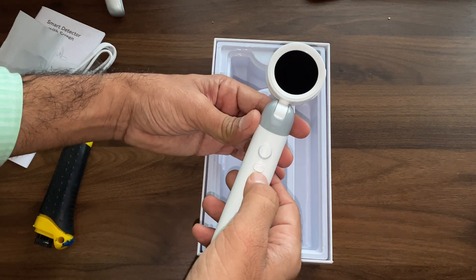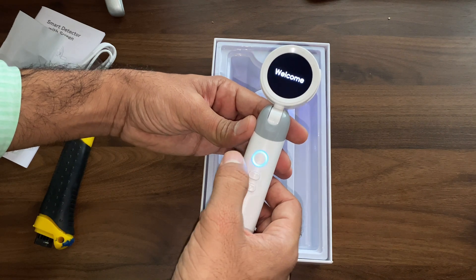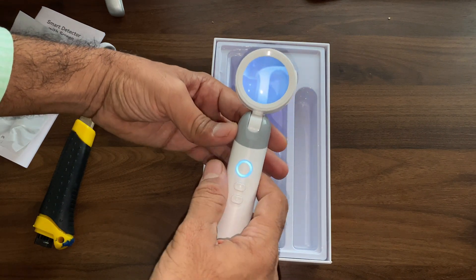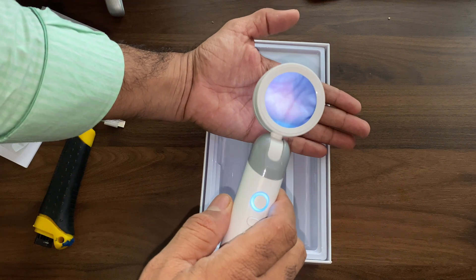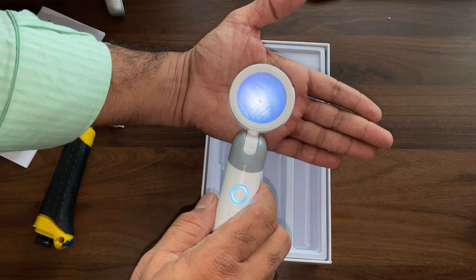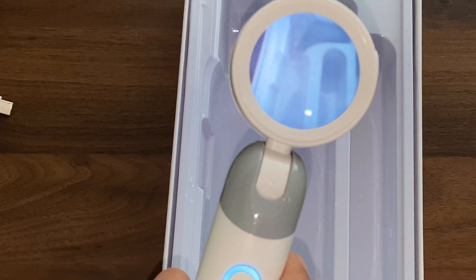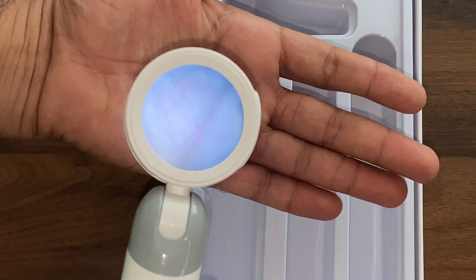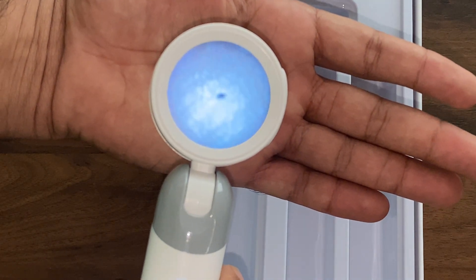At the bottom we can check the charging port. Over the instrument we have 3 buttons mainly. The first button is the signal indicator: a red light indicates charging, the light turns off when fully charged, and a blue light indicates it is operating.